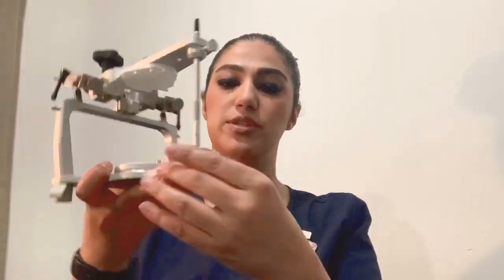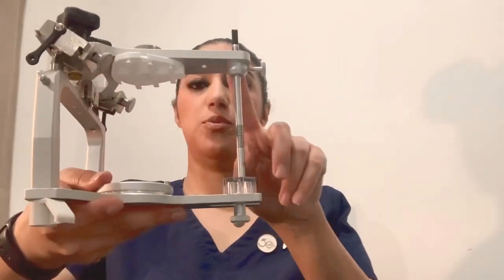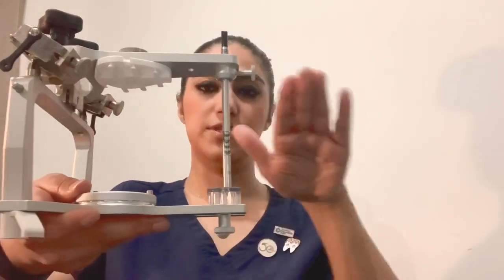You can screw it in, and this is your incisal table. You can see it sits nicely, and the upper part is completely parallel with the floor.